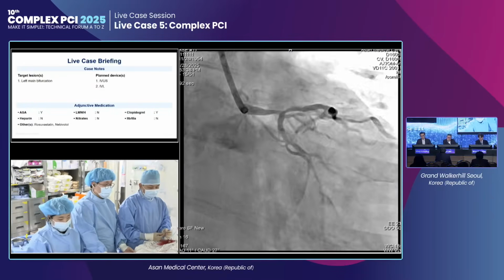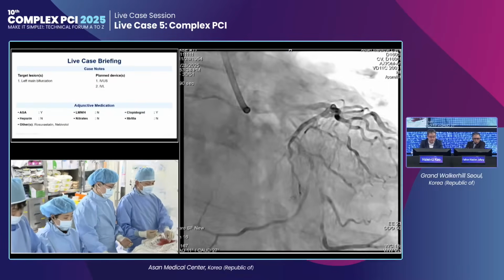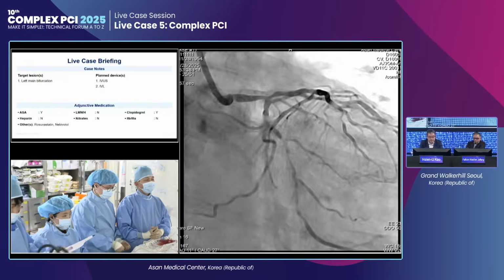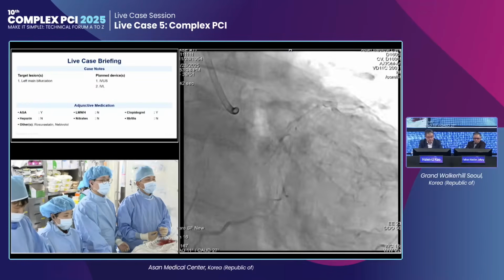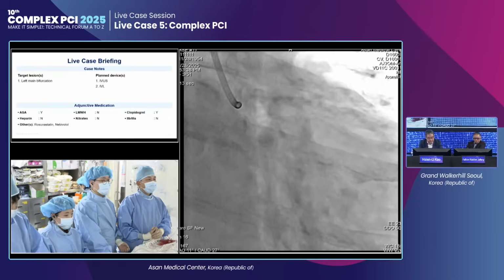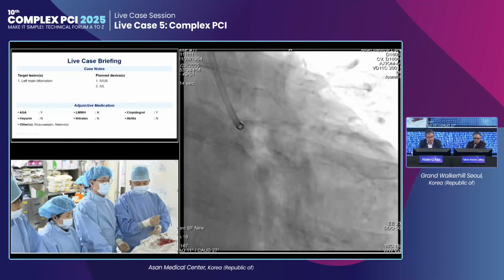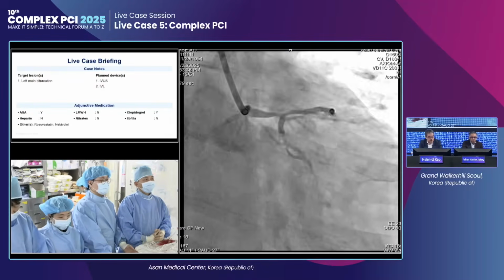Clearly very complicated. Heavily calcific. The ejection fraction is normal, right? Yes, normal. Okay. So, Paul, how would you do this? Would you do this with mechanical support? Well, obviously, this is a left main plus triple vessel, and all are diffuse, heavily calcified. So back in Taiwan, the first thing is that we will have our surgeon meet with the patient and the family for shared decision making, because obviously surgery is not a bad idea.